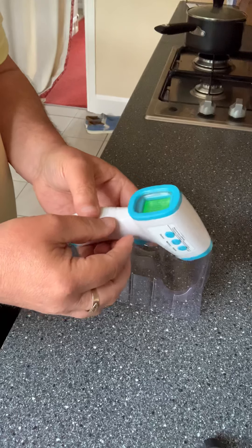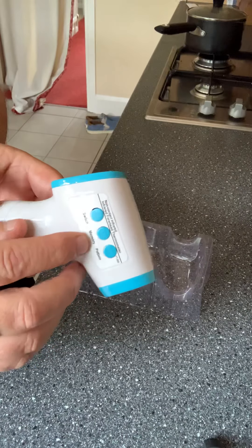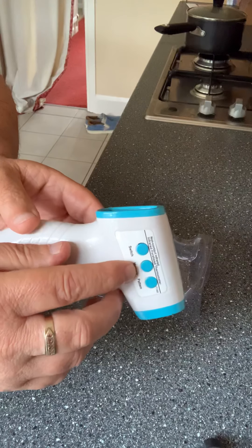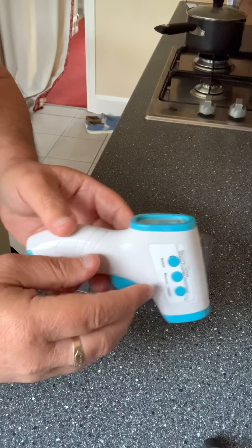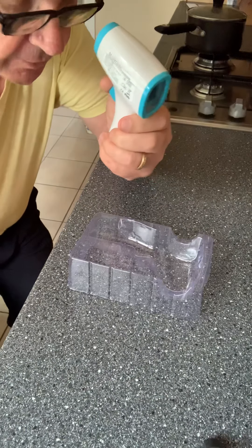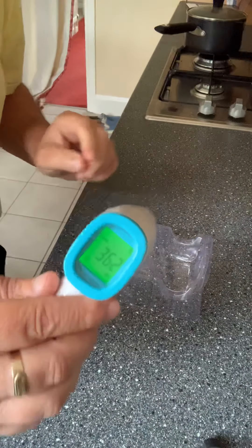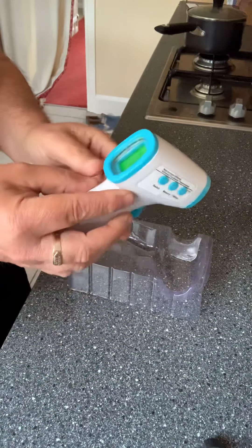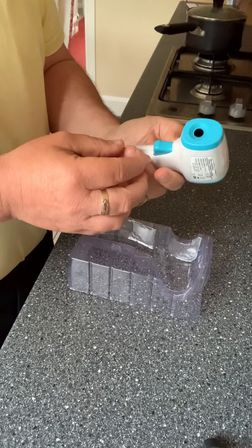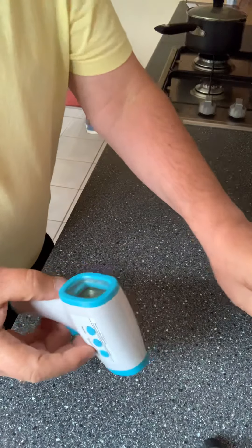It also has a memory button that saves readings — I don't know exactly how many it stores as I haven't tried it enough yet. If I point this to my forehead, when it beeps it tells me I'm 36.2, and that's on body mode.